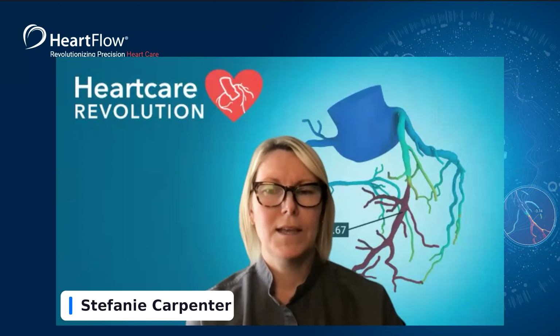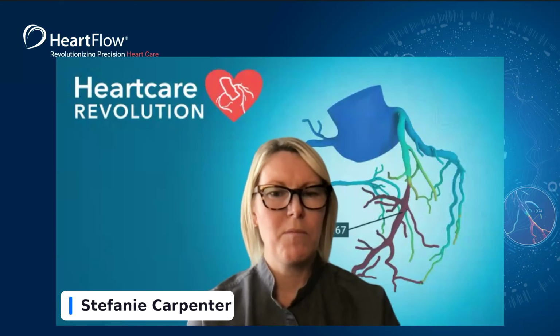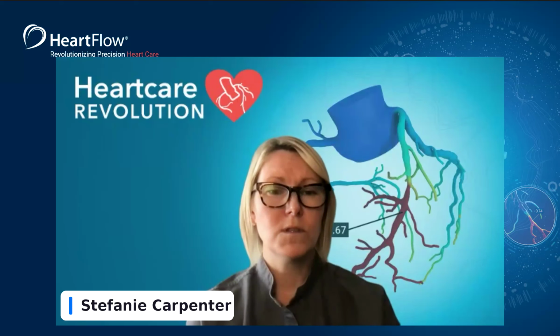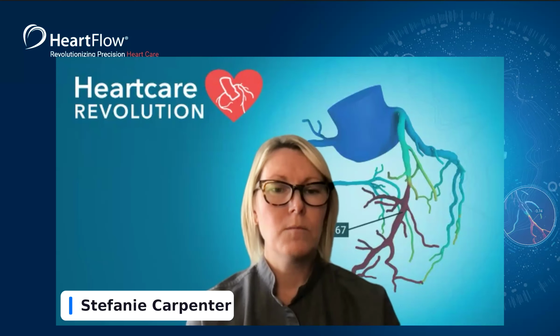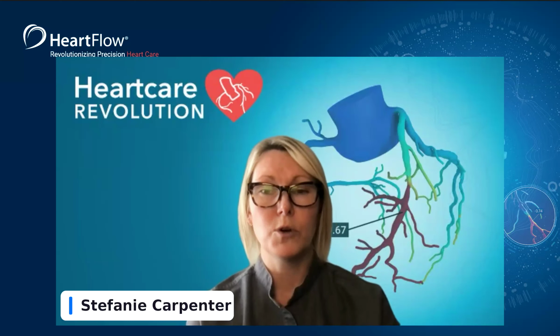Okay, so I'm going to take a guess on this one because I'm not super clear on it, and Amanda, you can jump in. I'm thinking that the range he's talking about is for their dose, so the range comes up as 20 to 80, and they're manually adjusting it to dose the patient for 40 to 70%. That's my assumption. So if the imaging falls outside of those parameters, they're just not going to have full dose, and the image quality will be a little bit less than it is in that 40 to 70 range.